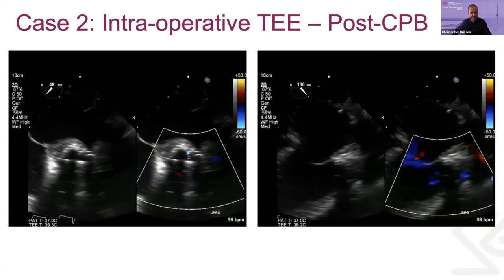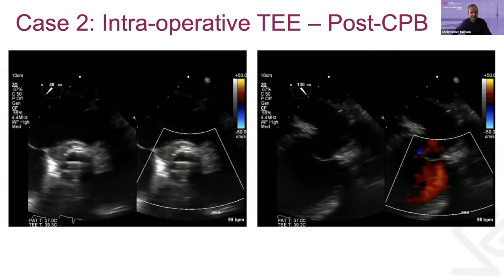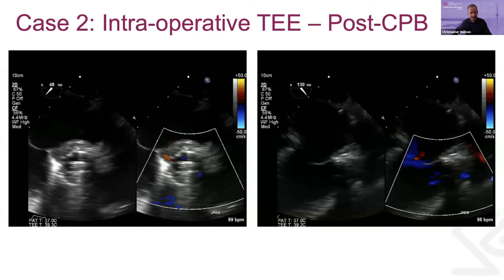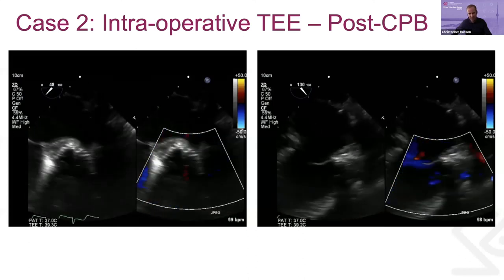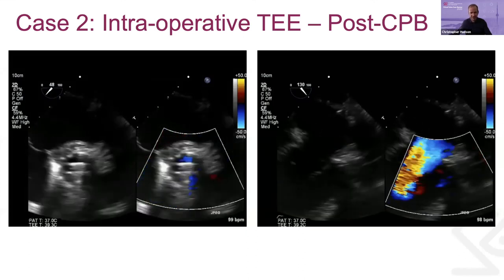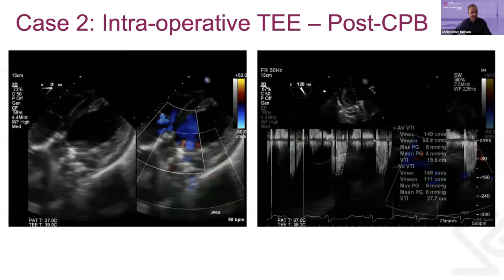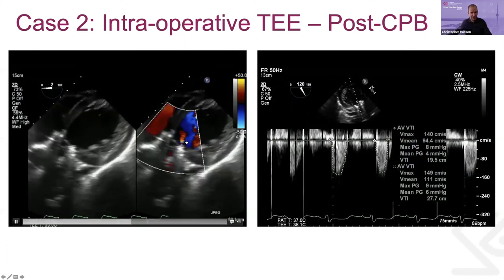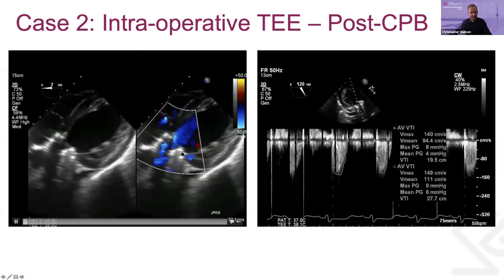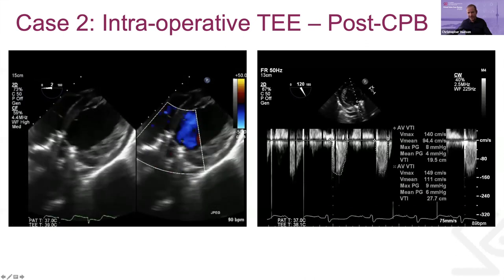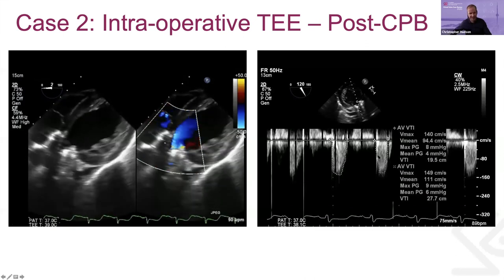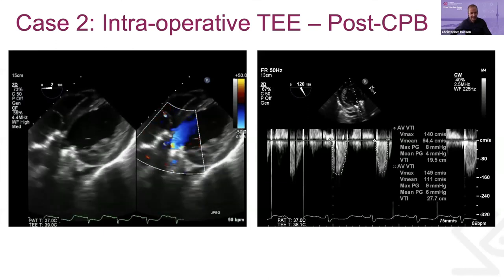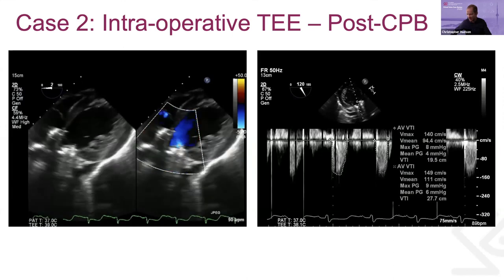To finish the post-op images for case two, the gentleman underwent prosthetic valve implantation — similar to before, good function and all leaflets working. On these images there is no significant leak, though there is acoustic shadowing beneath the valve. In the deep transgastric view, there is a small jet that is likely a normal washing jet for a mechanical valve, and we get a nice mean gradient of 4 mmHg — another successful valve replacement. That ends the presentation.